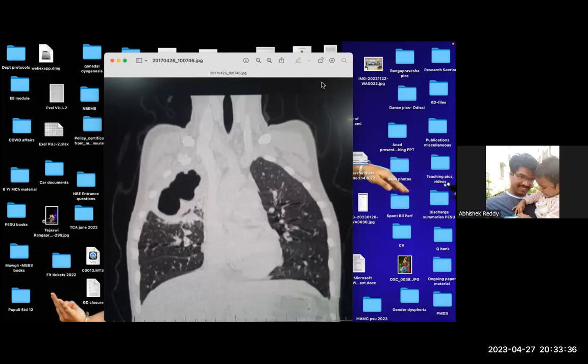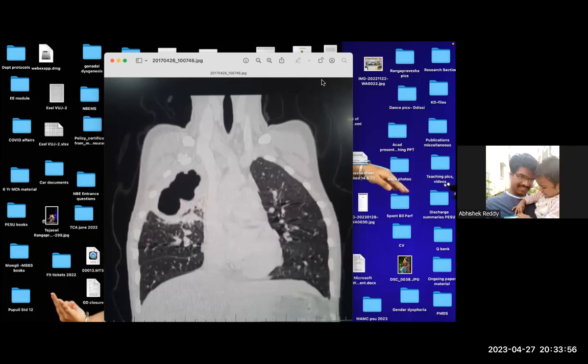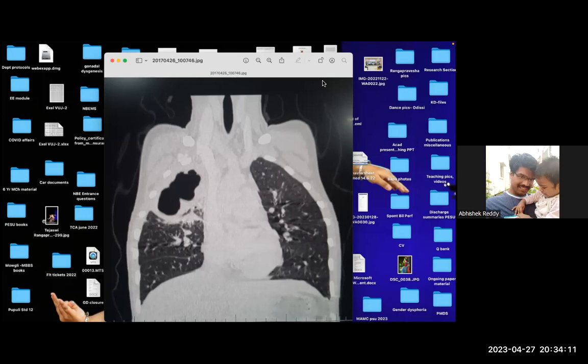One is CCAM, what you were saying. If it is a CCAM, then it is a macrocystic, a large cyst, sort of airway malformation, where there's one dominant cyst and maybe other smaller cysts, which we are not seeing in this section. So that is one. What else? It can also be a necrotizing pneumonia. Yeah, it can be a necrotic wall, a shaggy abscess wall, etc. That is also possible, right? Then something else, right upper zone, apex.